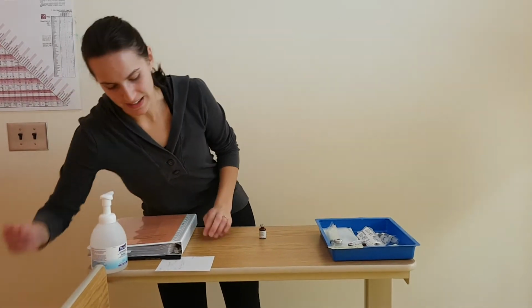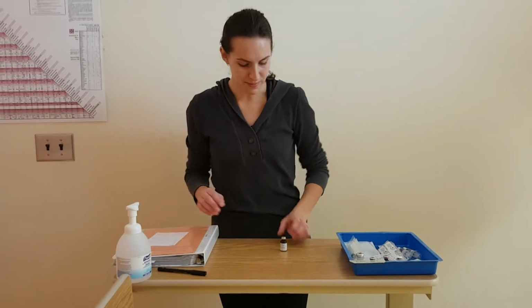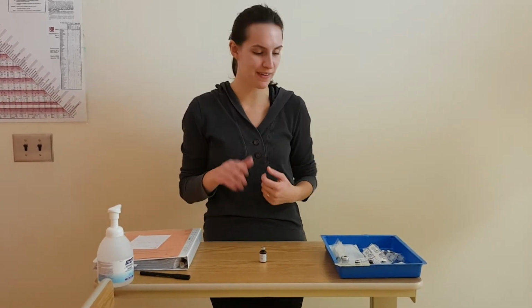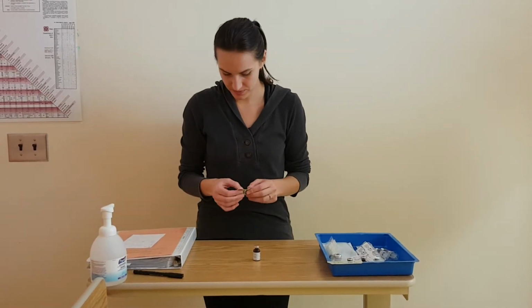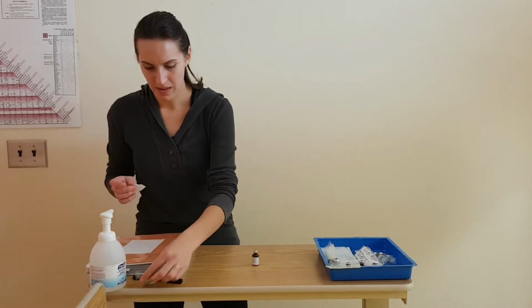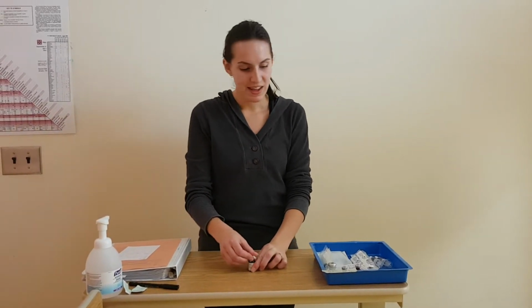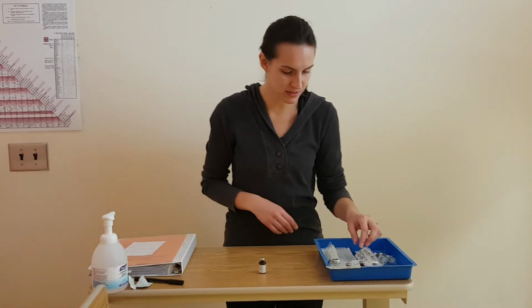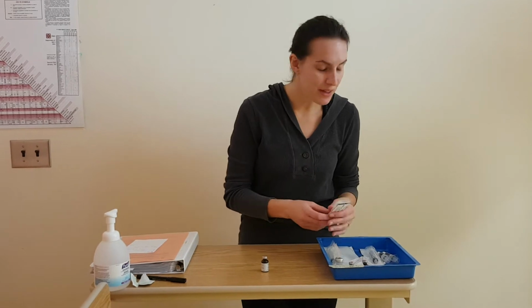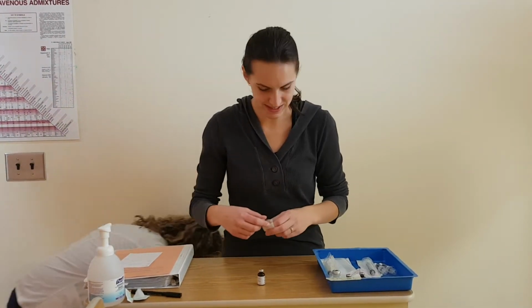So my drug calculations, I've determined that I need to draw up 4 milliliters of medication with an additional 1 milliliter of normal saline in order to get that 5 milliliters in a 10 milliliter syringe. I'm going to swab my vial for 30 seconds and let dry for 15. And I'm choosing to dilute the medication in normal saline because my patient has no additional need for calories, and it is compatible with my primary solution.